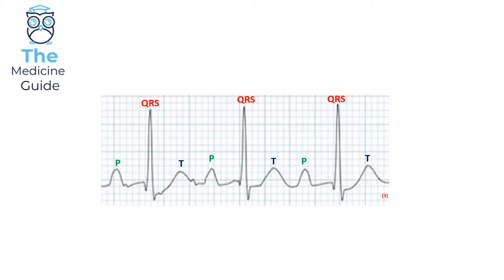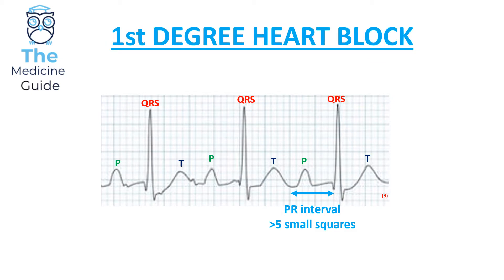Hopefully after looking at the ECG you would have noticed that the PR interval is prolonged. If you have a look at the example in the blue writing, we can see that the PR interval is more than five small squares. This is an example of first degree heart block. In first degree heart block, an ECG will present with a PR interval greater than five small squares.